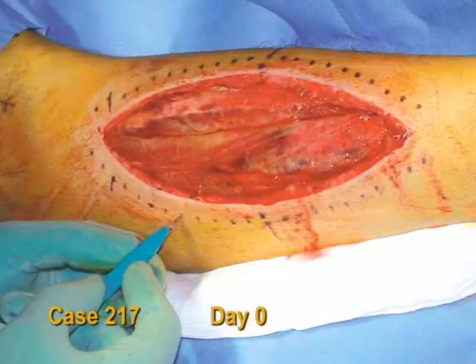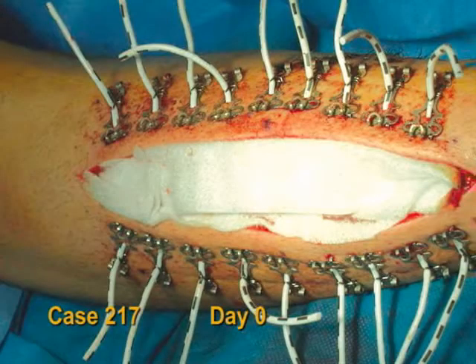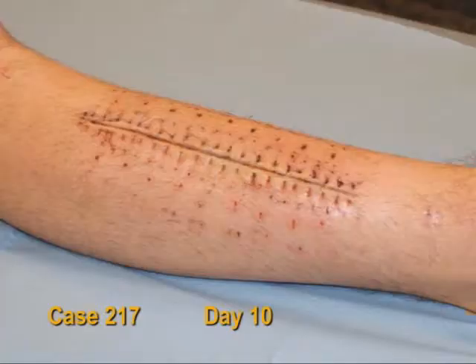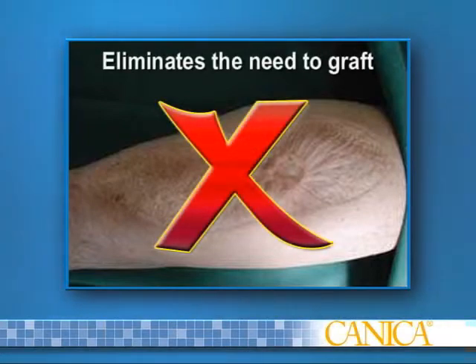Abra Surgical Skin Closure engages full-thickness skin and closes high-tension, retracted skin defects, leaving nothing behind except a sound primary repair. Over time, this dynamic wound closure system pulls the skin margins together under tolerable tension while normalizing compartment pressures. The Abra system eliminates the need to skin graft by re-approximating the skin margins, resulting in a primary closure.